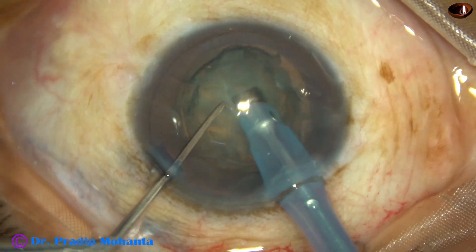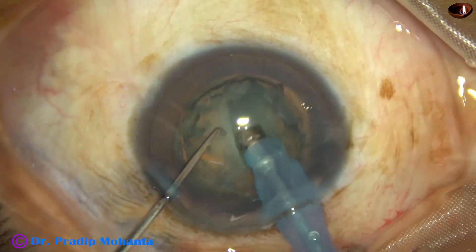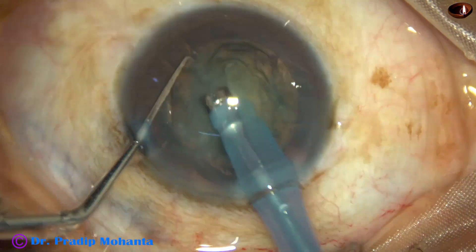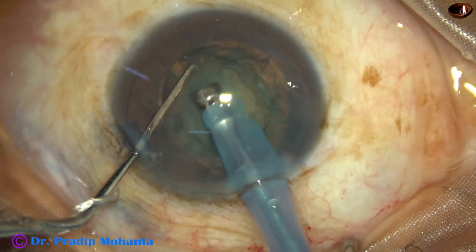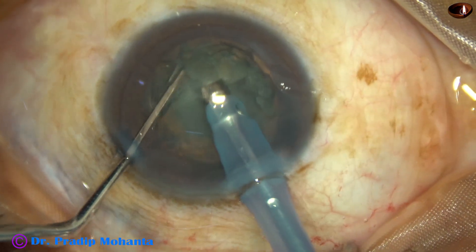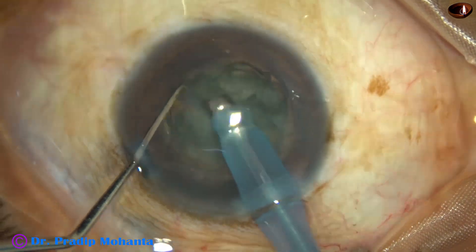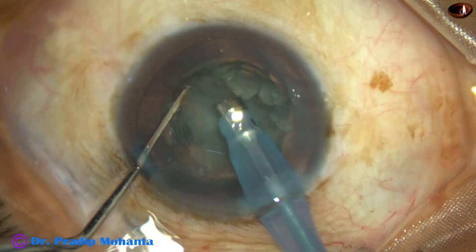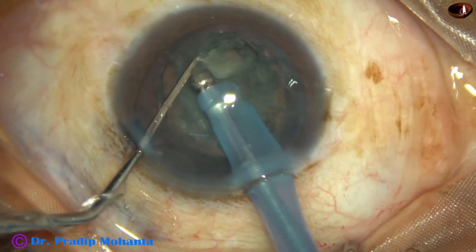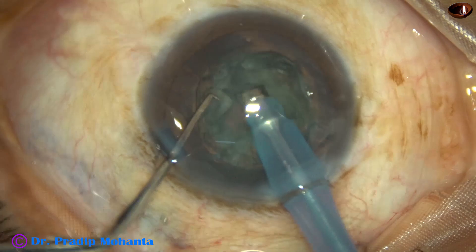And sometimes this happens — the two halves are not equal. The half on the right side is bigger. And now, after 180 degree rotation, you can see that. Now, one trench is made on the bigger half. So we have made a trench, and from that trench, another trench. So it has become a T-shaped trench.